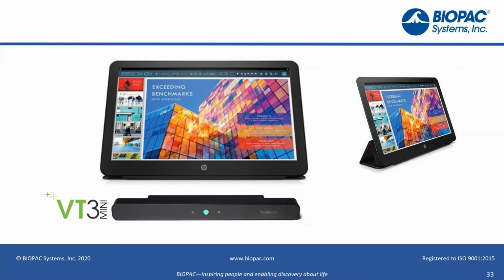So for those of you that want to go out in the field, you're not necessarily set up in a lab permanently, these types of displays or the tablet solution that Keith mentioned in his presentation really make for a very portable solution. You use a laptop computer with one of these displays, take your Smart Center or MP160, and you've got a very portable system.